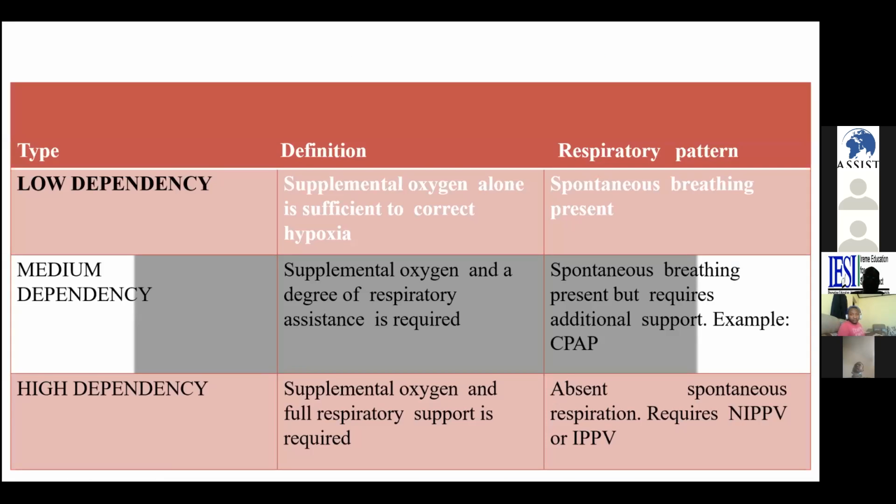Next, please. Okay, let's talk more on this table. Here, I want to emphasize on level of oxygenation and intervention which can be done. During oxygenation, we have 3 categories of patients.